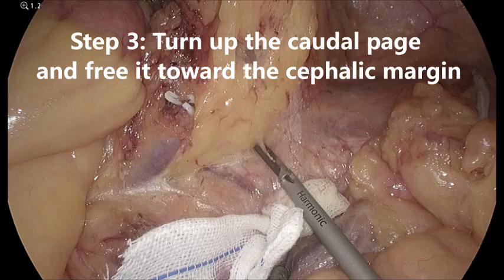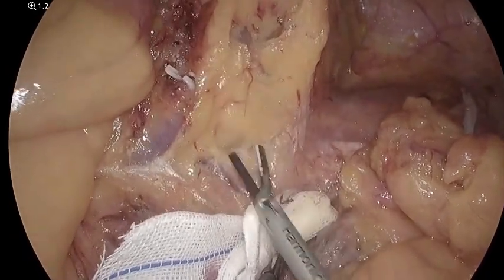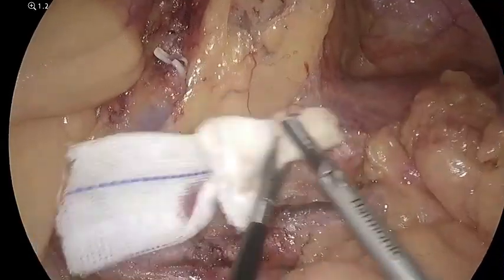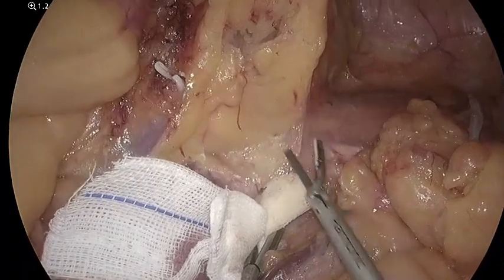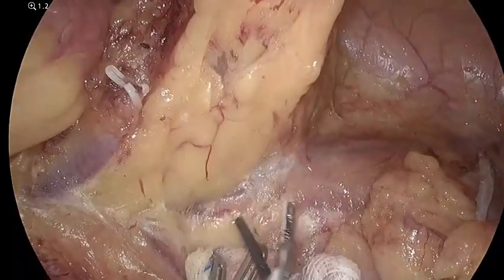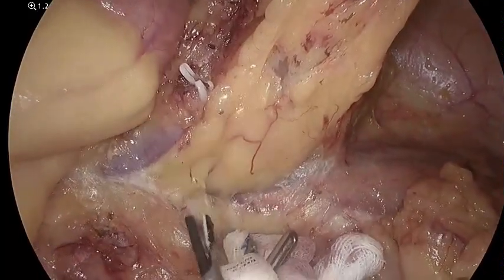Step 3. Lift the caudal page and proceed with the dissection towards the cranial direction. Similar to turning a page, the assistant gently pulls at the transected ends of the left colic vessels and the sigmoid colon, pulling them ventrally and cephalically, thereby lifting the colon and its mesentery.